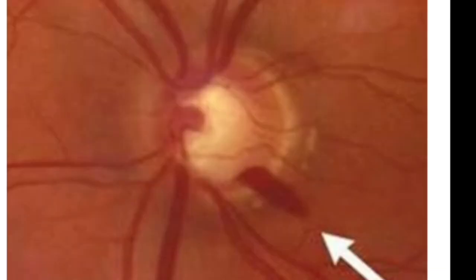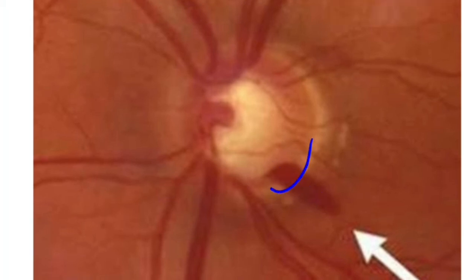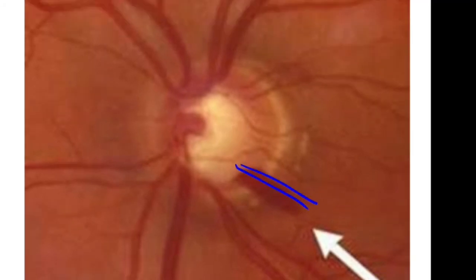Coming to the next feature seen over the optic disc, the optic disc hemorrhage. These are splinter shaped hemorrhages which typically cross the disc margin. These can appear and disappear, and when you examine the patient again once more it may reappear. So this is not a constant finding when you examine the optic disc. Even the papillary part of the hemorrhage can disappear sometimes, leaving only the visibility of the extra papillary part of the hemorrhage. Okay, the common location is the inferior quadrant.